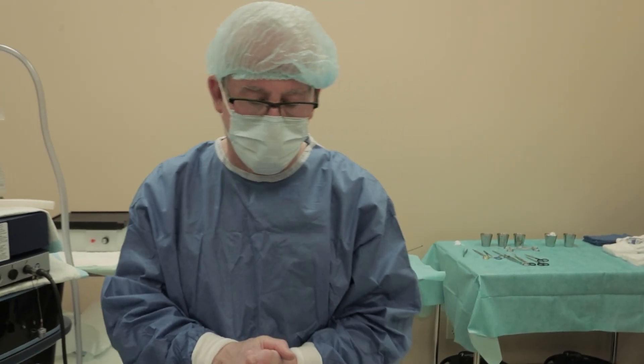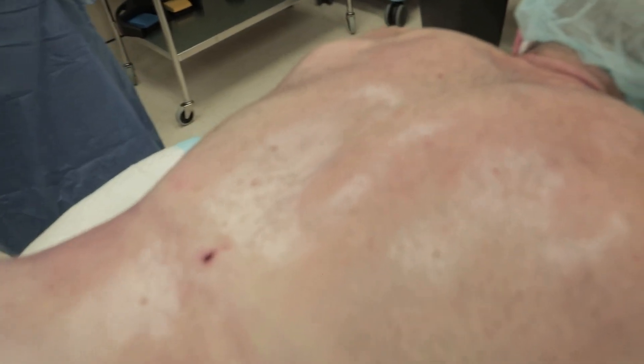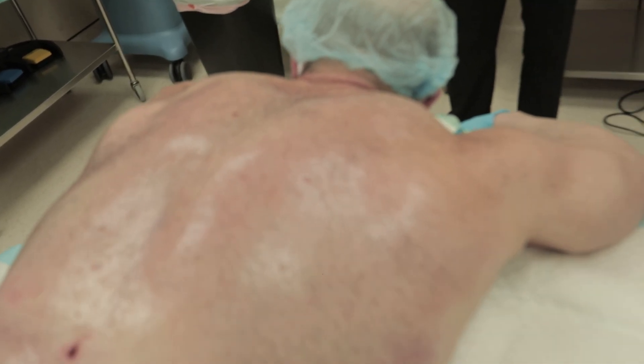So I'm finishing up here. We just finished up his back. We did the front, as you see, and the back we just did. We got to do 360 — this guy deserves the best. He deserves Lebo, and this is what we got him.